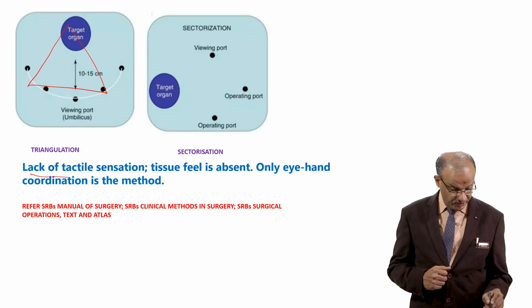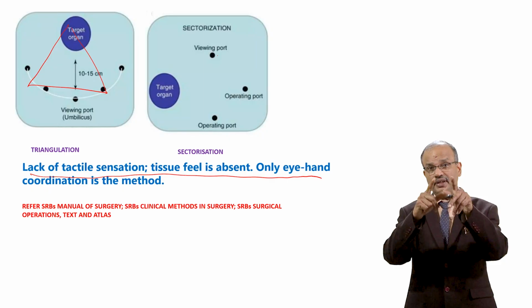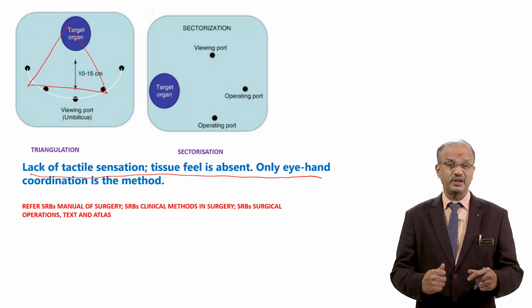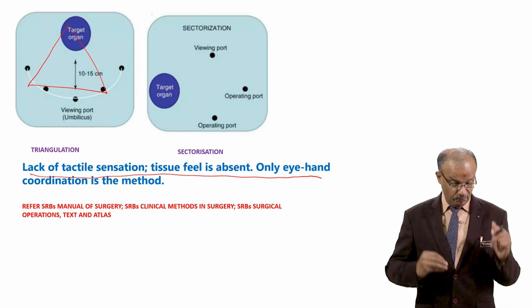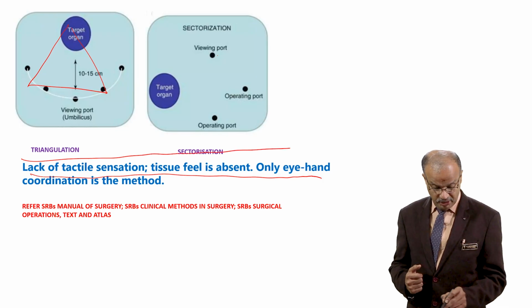Lack of tactile sensation. Tissue feel is absent. Only eye-hand coordination. So look at the monitor like this and do the surgery like this. Hand-eye coordination is important. There is no tissue touch. No tactile sensation, tissue feel is absent. This is a very important point. Remember.